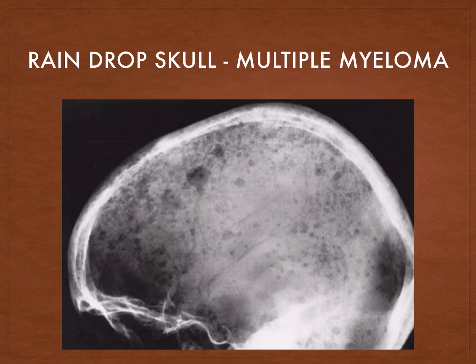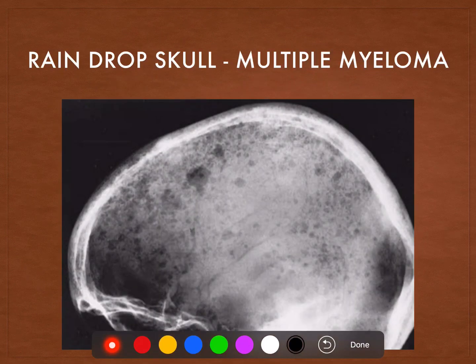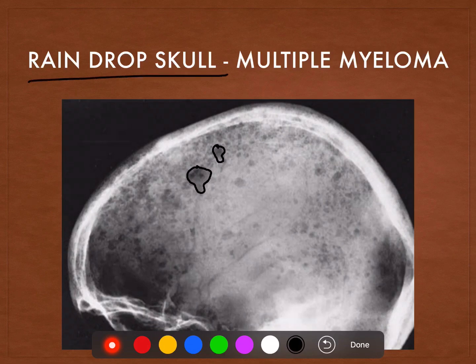In this first X-ray, we see these multiple well-defined punched out lytic lesions seen scattered throughout the skull. The name of this skull is the raindrop skull and the diagnosis here is multiple myeloma. So, multiple punched out lytic lesions throughout the skull — multiple myeloma.